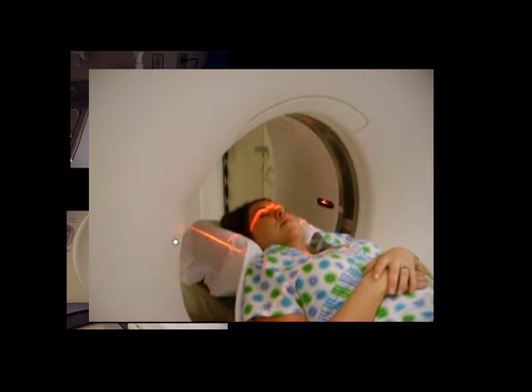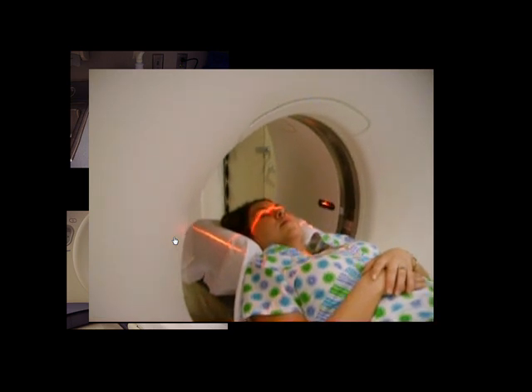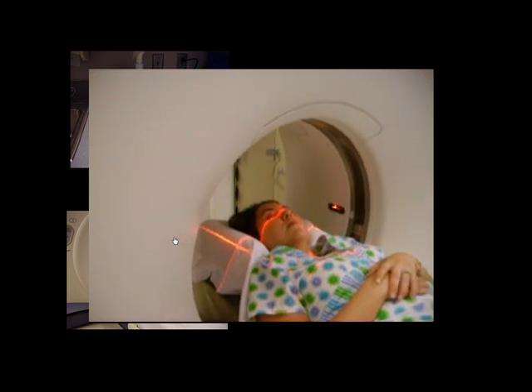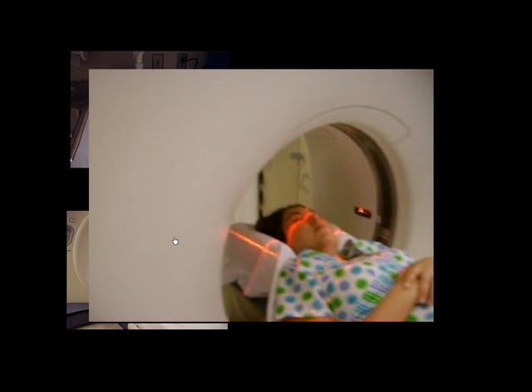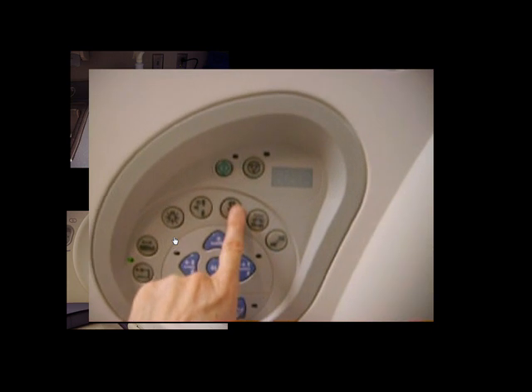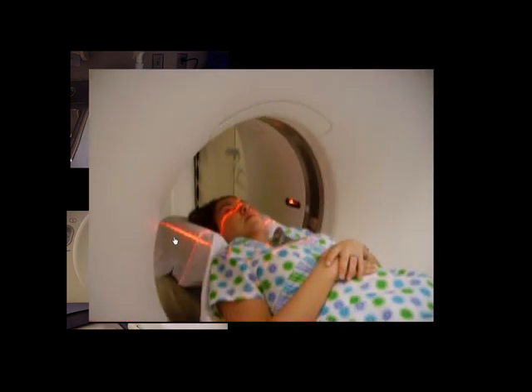The inside light axially is going to be at the orbital meatal line. The light sagittally will be at the mid-sagittal plane, and the light coronal will be right on the EAM. Now there's the button that you push if you're setting that inside line. So this is what the patient looks like once they're inside the gantry and positioned correctly.